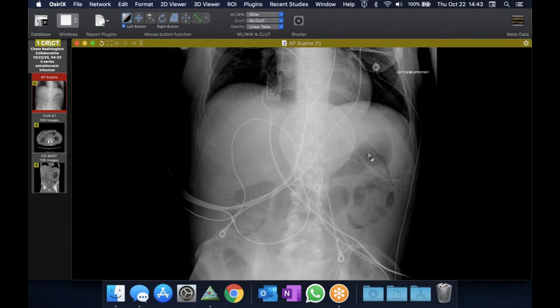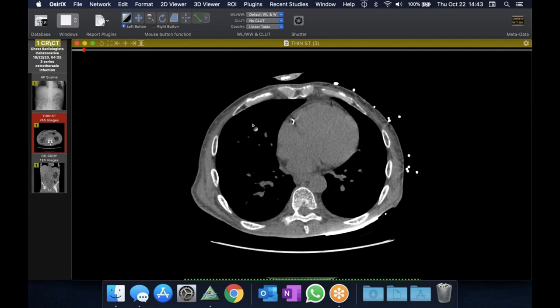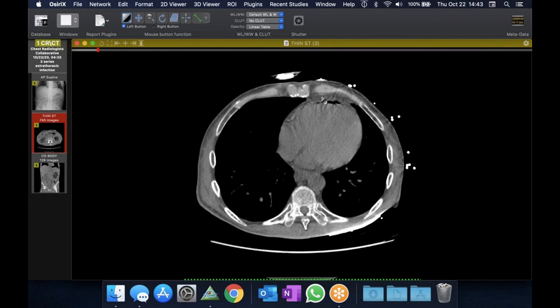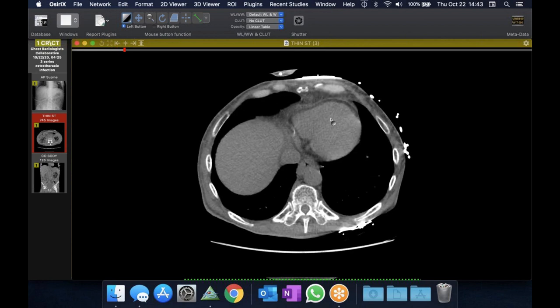And if you look on this abdominal radiograph, you can see these funny lucencies in what we expect to be the locations of the kidneys. This was a diabetic patient who came in quite sick. And this was his abdominal CT. And there are some chest findings, actually. There's a lot of gas in the right ventricle, which would be a little unusual, even for a little bit that gets in during an IV.